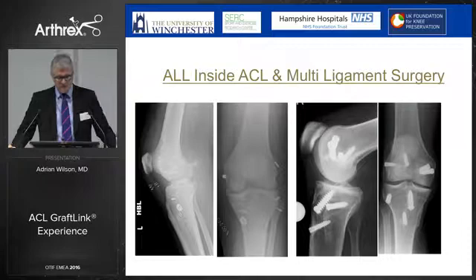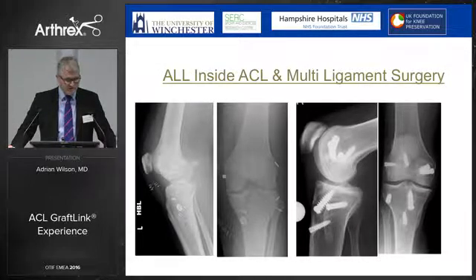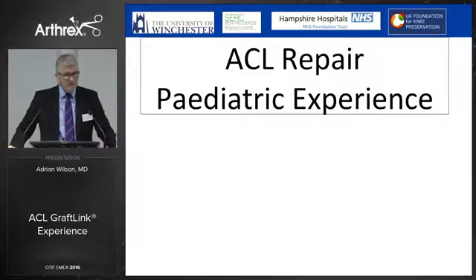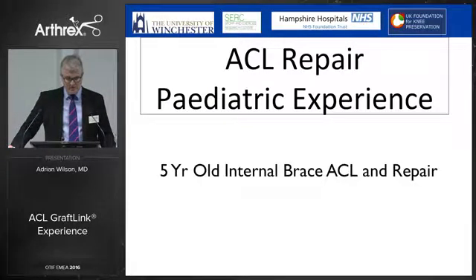This is a grenade that's gone off on the right-hand side. This is where we were as patients were being referred in and having one go after another, and it just makes the point that the hardware is an issue. And with these low-profile buttons now, we have this elegant way of carrying out this complex surgery. So what about using the concepts of All-Inside in the paediatric cases?